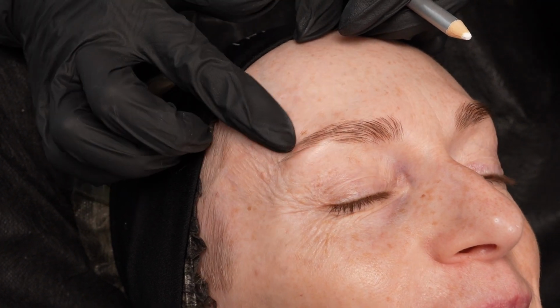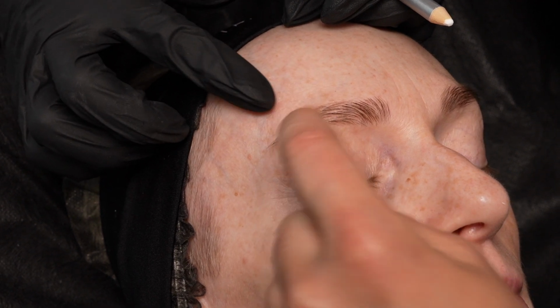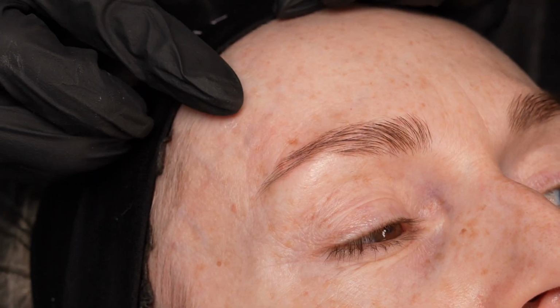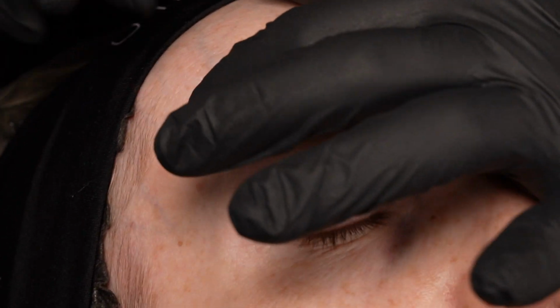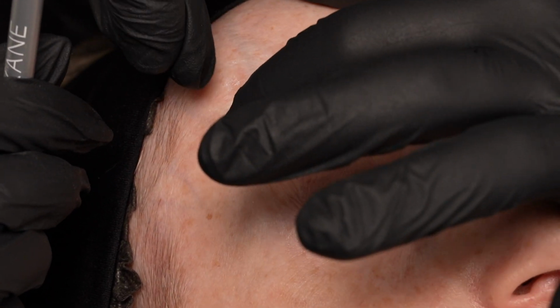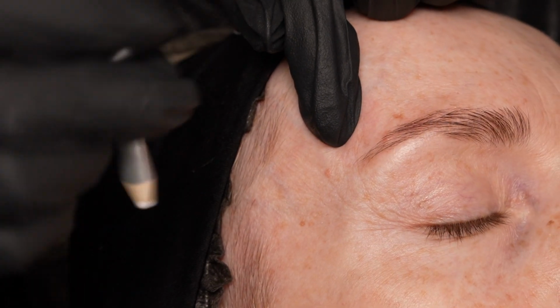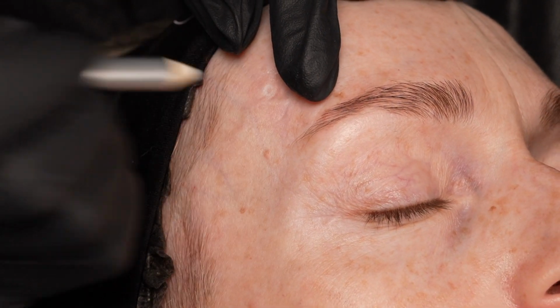Хорошо. Да, вот здесь вот, да, получается? Нам надо вот здесь сделать точку вкола. Нет, это гребень, вы выше. Гребень мы выше, получается, да, делаем. How big is the distance from the eyebrow you recommend? I don't have any rules. У него нет никаких правил, то есть высоту, точку. Okay, this is, for example, I can say. Я чувствую гребень, да, и получается... И с него легче заходить. С него легче заходить, да? But yes, perfect. Вот здесь.